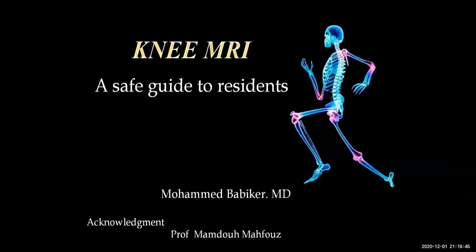Hopefully it will be a useful guide for how we can approach a knee MRI for patients who are complaining of a knee problem.